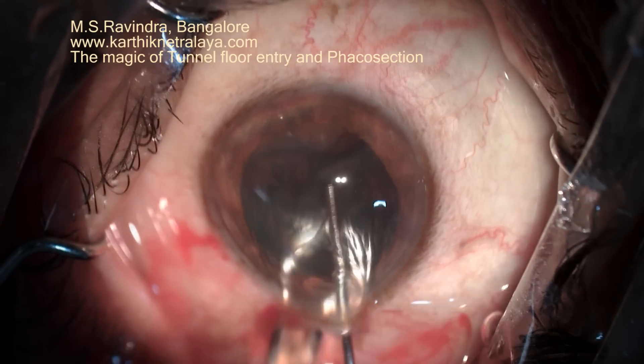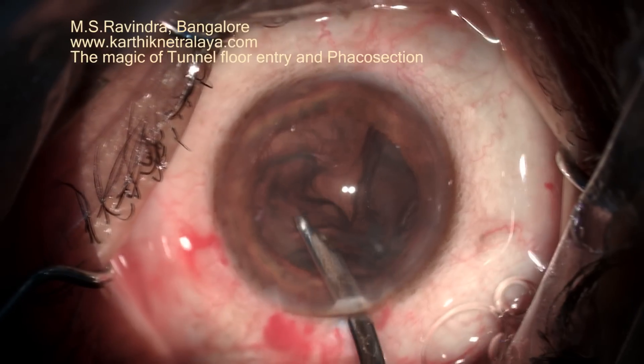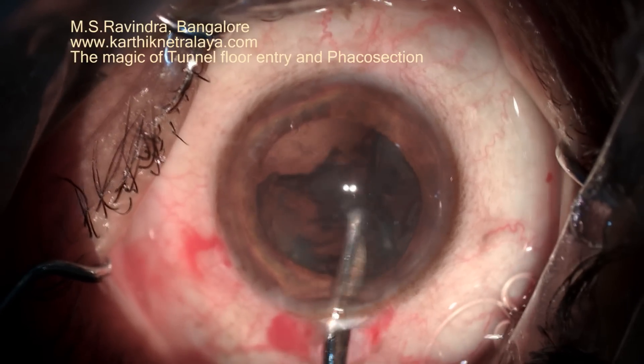The cortex is now aspirated completely, and then the intraocular lens is implanted with an injector.